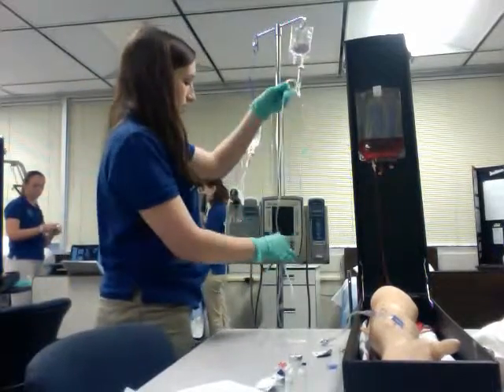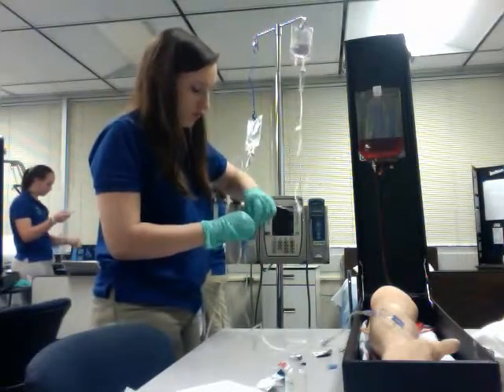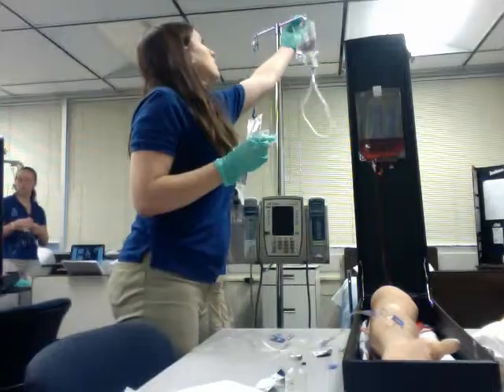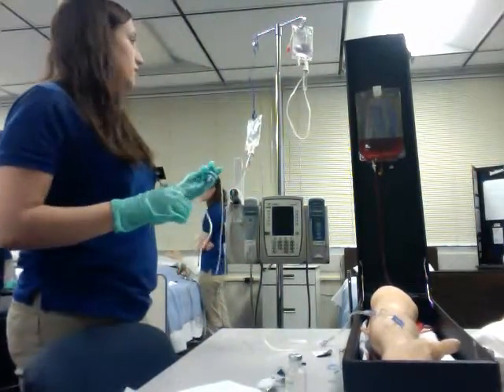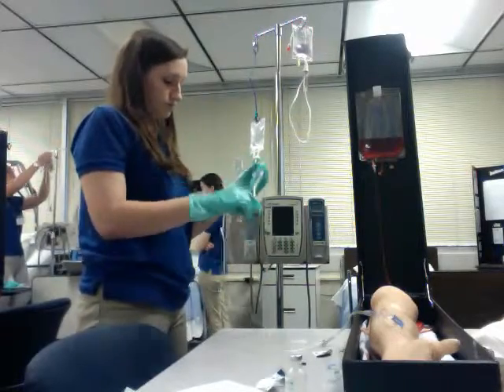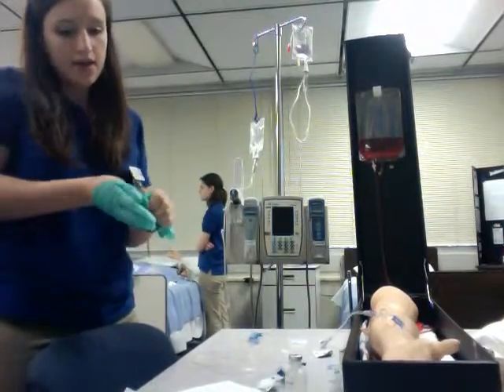So I'm going to start by clamping off the piggyback line again. I'm going to remove the line and apply an alligator clamp to it so it can be used at a later time. Okay, and now I'm going to unclamp the primary line so that that can start infusing, and I'm going to reestablish the flow rate. I'm going to discard all my materials, remove my gloves, and perform hand hygiene. And then we are done here.